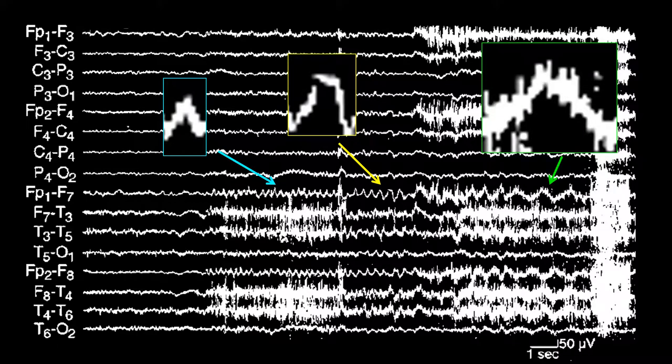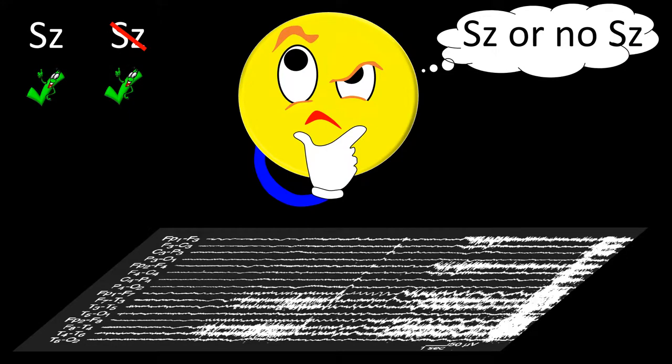The third wave I have chosen is again triangular, and as you can see, the evolution of the shape of the single wave within the rhythm is minimal and gradual, thus consistent with an epileptic seizure. So, a yes for the seizure column.